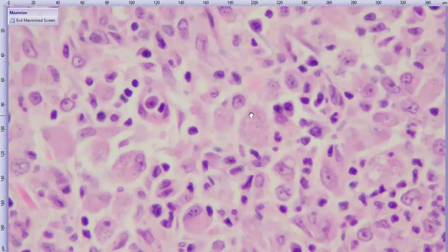This is a good point, because this is relatively atypical. I've looked at almost all of our cases at some point because I was doing a retrospective study, and in most of the cases without a GMS, it was really hard to confirm. This was one of the most obvious ones I've seen on H&E. This is beautiful, so easy to provide an answer.